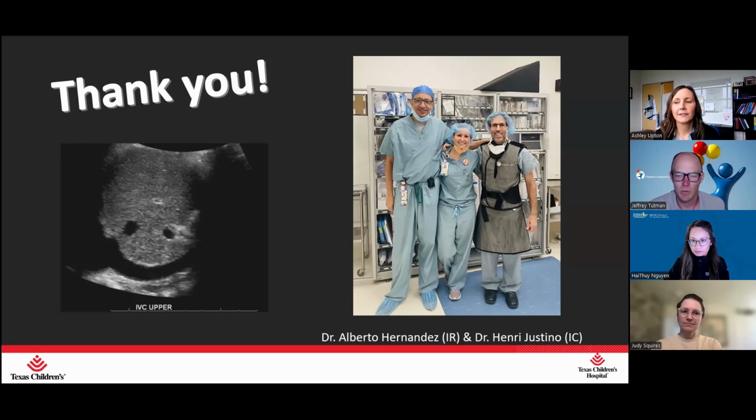That's a great question. I think it's a hard question to answer because it is really vendor specific. At our institution, we have GE machines, so any literature that we pull, we make sure they used GEs for their studies. We were able to find some literature with GE vendors, and they did liver biopsy proven numbers. So we have values for little babies on our machines that should be closer to 1 meter per second, and then it trends up. I think at age 6, 1.1 would be normal.